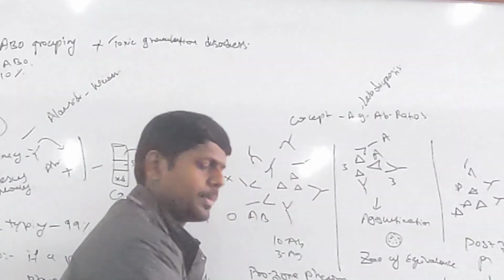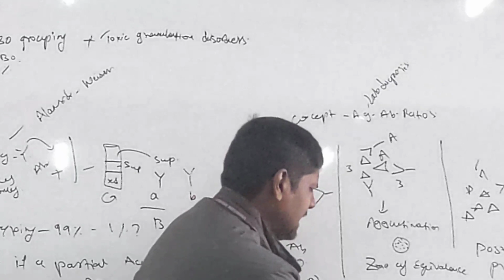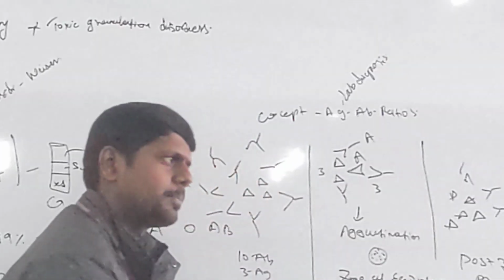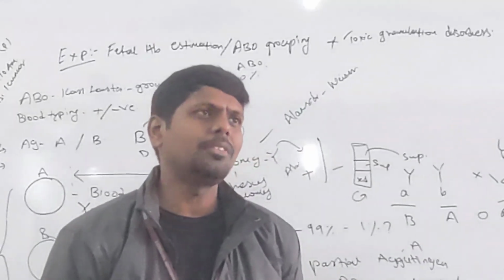I will take a slide. What is the right approach, tell me students? Shall I keep anti-seras first, A, B, D, or shall I keep blood first? Blood first or antibodies first? Tell me students. Blood first.